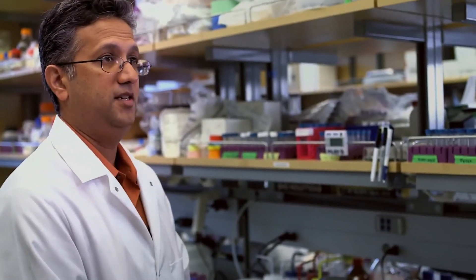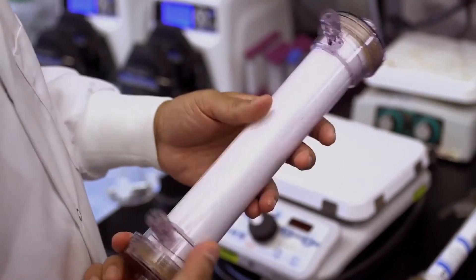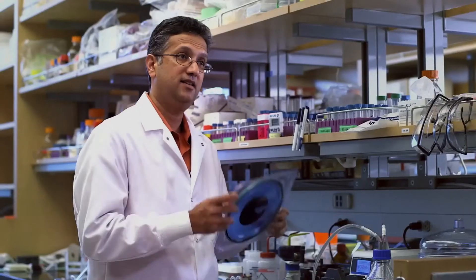So, a current dialysis machine is the size of a refrigerator, and the key component in that is a dialysis cartridge. There's about two square meters of surface area. To get the same amount of filtration, we need 1/20th in the silicon filter.